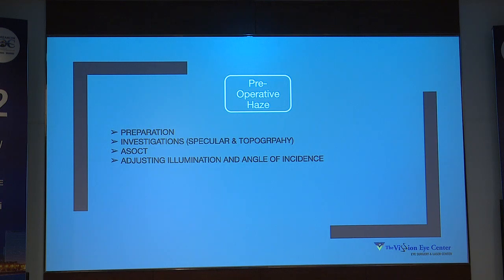Specular and topography. I've learned gradually in life that every patient of cataract, you must do a specular, you must have an endothelial cell count in your hand for your own sake and from the medical legal standpoint. Your sake because you might use a lovely technique, sandwich technique, whatever that you want to use, we'll discuss that further. But for your sake, you must know which cornea you are going into.